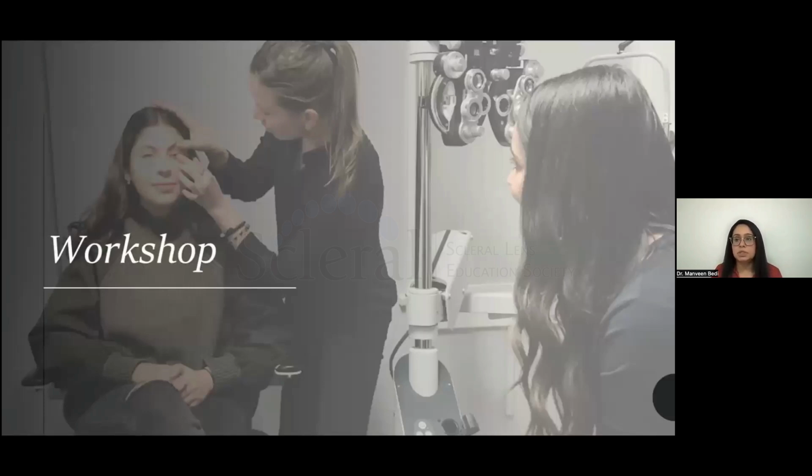The other thing is workshops. The workshops are done quite frequently initially, and then as the staff is trained and well equipped, we taper down on the trainings. In the workshops, we'll sometimes have a corneal lens workshop, a scleral lens workshop, or a hybrid. Here we are teaching our staff members to apply and remove the contact lens. It's always important that they can touch and feel the contact lens and perform the skill, because it becomes easier for them to train the patients when they come in for their training sessions.